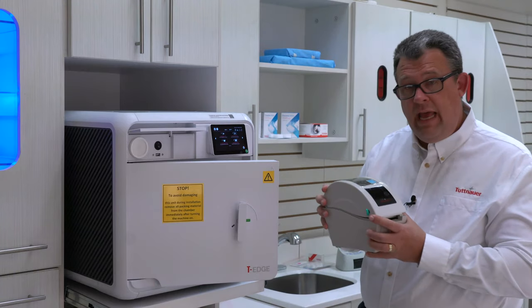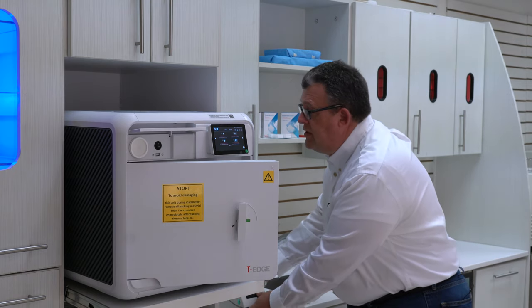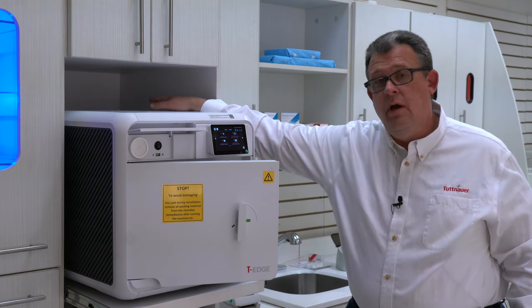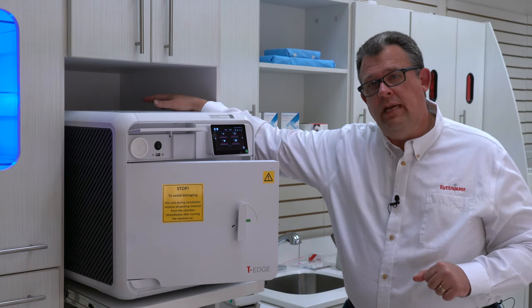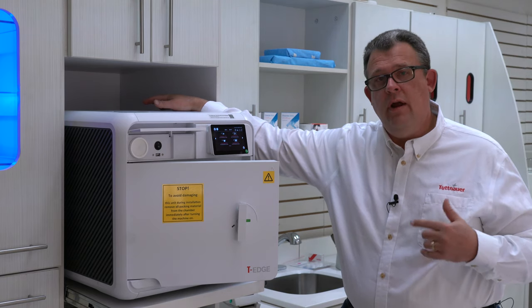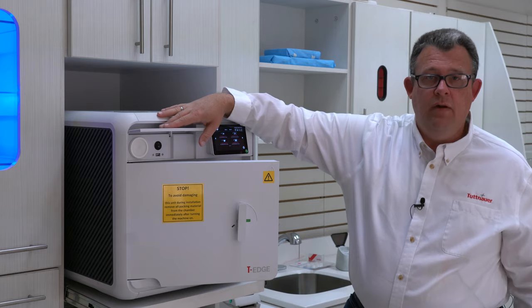So after I've done that, I put in my paper, I hooked up the USB port, and the autoclave is completely off. Now I'm going to turn on the back switch. I'm going to wait two minutes, because we're allowing the driver to address the printer. After I've waited two or three minutes, then I'm going to turn on the front on-off switch.